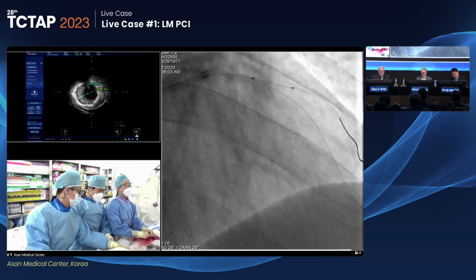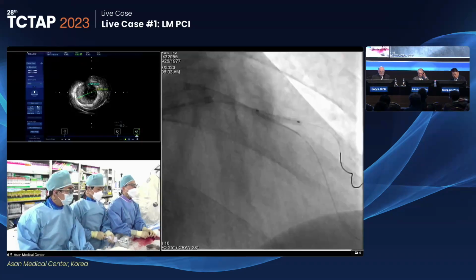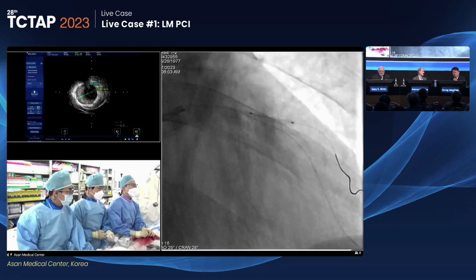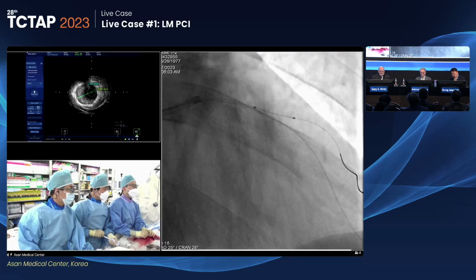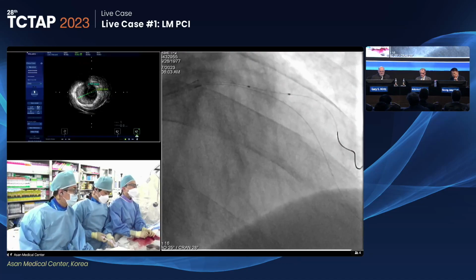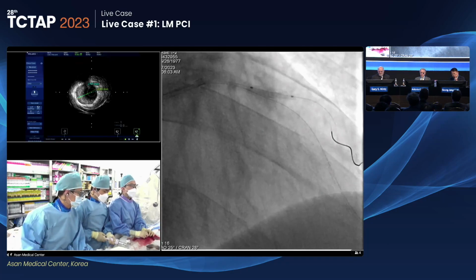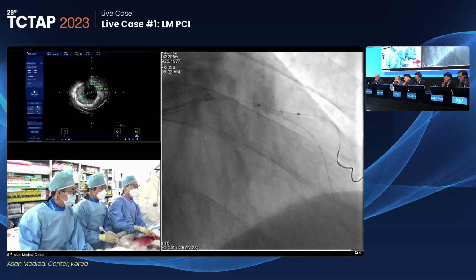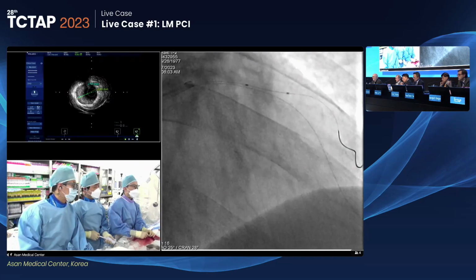Wow, look how easy the balloons deliver, but the stent doesn't deliver. Interesting. I wonder if it's, you know, sometimes when we're wiring bifurcations, we won't wire the main branch first because it changes the angle. I wonder if having the balloon in the LAD is changing the angle so much. And then, the other option is to deliver a guide extension catheter over this balloon, and then you achieve your goal to stent the diagonal. I can feel some resistance here.